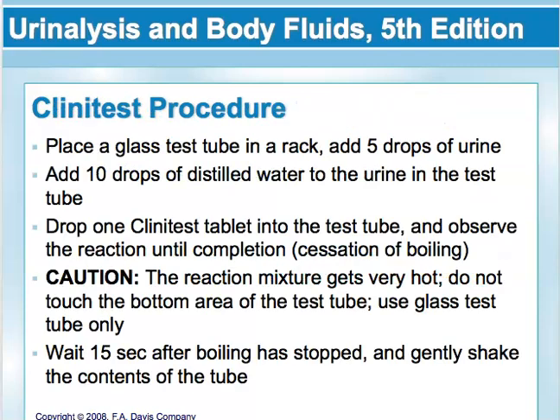The CliniTest procedure, and again, there's a video in Moodle. Please watch it. It'll help this procedure make sense. But this is a tablet. The tablet contains copper sulfate, sodium carbonate, sodium citrate, and sodium hydroxide. So you have to use a glass tube where you add 5 drops of urine and 10 drops of water. The tablet is then added to the water and urine solution.